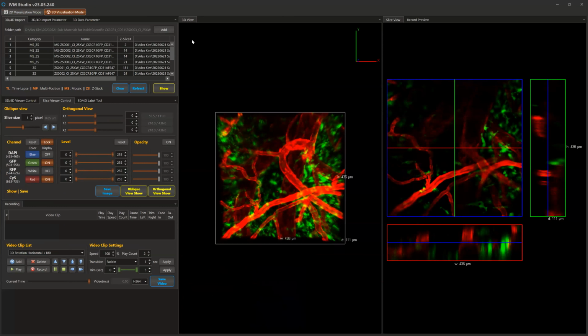In this final chapter of our long journey, depth-wise taken sequences would be utilized for 3D reconstruction. After a few adjustments, I will make a video clip with a horizontally rotating 3D video for complementary data, just the same as I showed you during the imaging.